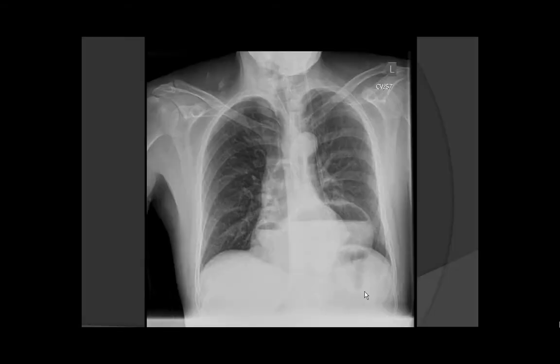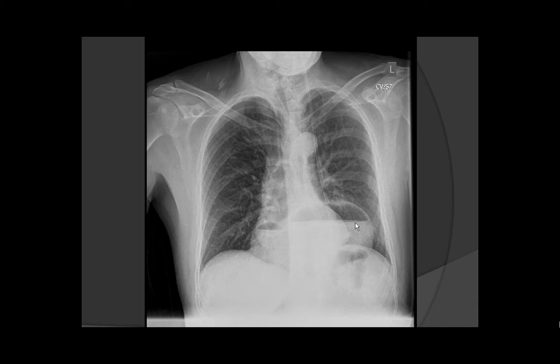A chest x-ray was obtained of this patient, and clearly the gastric contents were visualized above the diaphragm. Additionally, an air-fluid level was seen in the stomach.